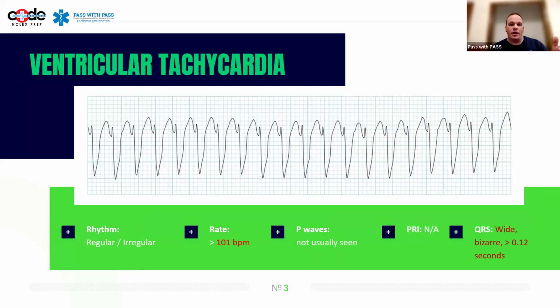Remember that if you're on a hands-on exam and you are getting EKG rhythms slid across the table to you, or you're sitting there watching a cardiac monitor and an instructor has a rhythm generator and he or she is changing rhythms and you're interpreting them on the screen as they go by, or if you see this happen on a patient, the very first thing that we should think of is, does it have a pulse? Okay. Because remember, ventricular tachycardia can either be pulseless, which we're going to talk about tonight, or it can have a pulse.